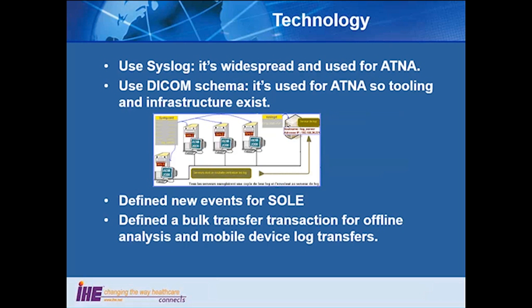The technology I won't spend a lot of time on. It's syslog, like ATNA. It's widespread. It's in use. The DICOM schema that ATNA uses and that is used for security events can be extended quite easily and was extended to operational events.